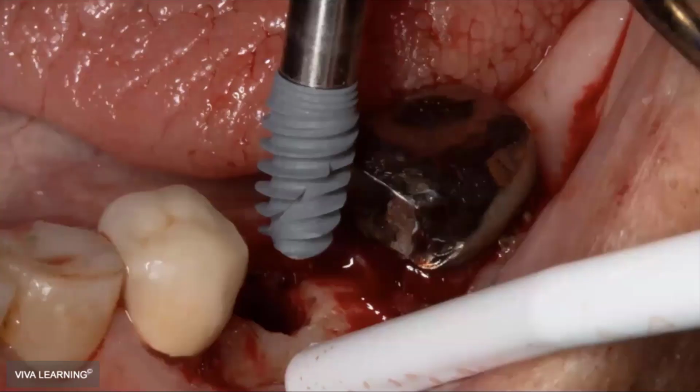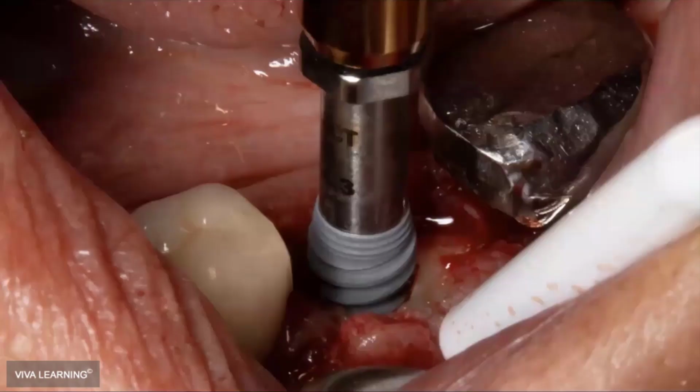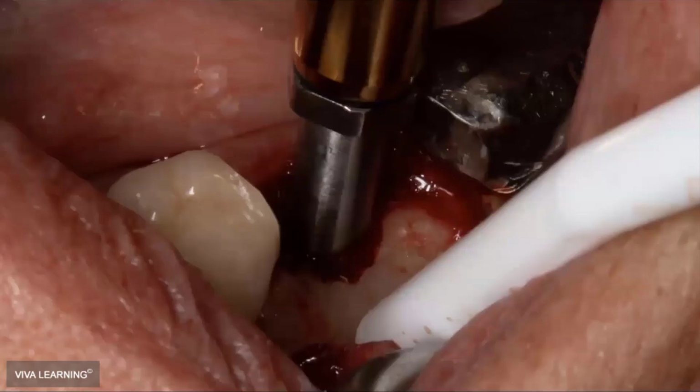And this turned into an oh wow moment. I have a fixture that's 10 millimeters long, and let's just try to drive this Nobel Active into the implant site. So I did that and got great torque on it. The osteotomy wasn't necessarily the most uniform looking thing in the world, but this is an aggressive implant. It went right into place. It drives itself, so the angulation changed ever so slightly, but it was a recoverable thing.